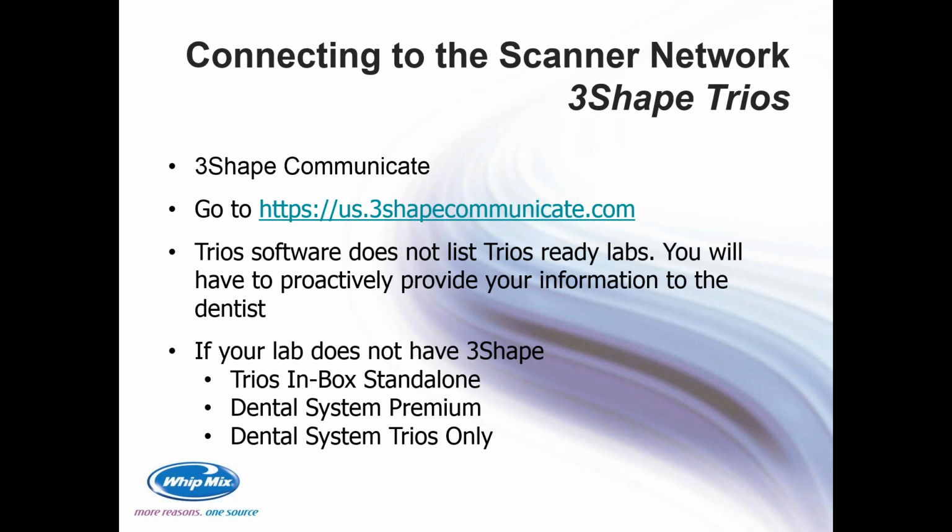And then once you have registered, there are steps that you have to go through, but at that point in time, it really comes back on your reseller to take you through those steps. They will then turn around and help get you registered. After they've registered you with ThreeShape, that takes approximately 24 hours, and you'll be able to configure your system to start receiving Trios files, and then they'll start walking you through the rest of the process to become Trios ready. One thing about the Trios software, it does not list Trios Ready Labs. I believe they are on the ThreeShape website, but they are not in the Trios software, so you will have to proactively provide your information to the dentist.